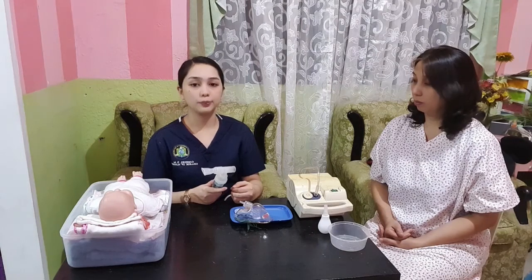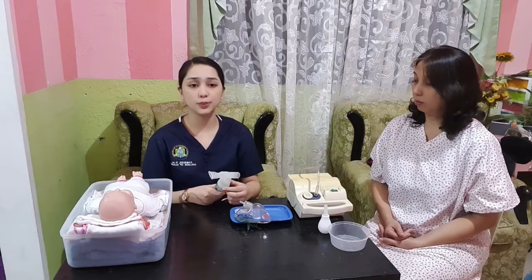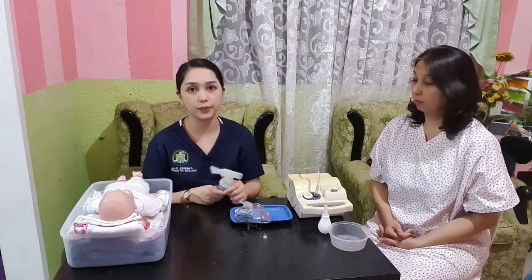Then, add prescribed medication and diluent if needed to the nebulizer cup. So this ensures proper dose and delivery of ordered medications.